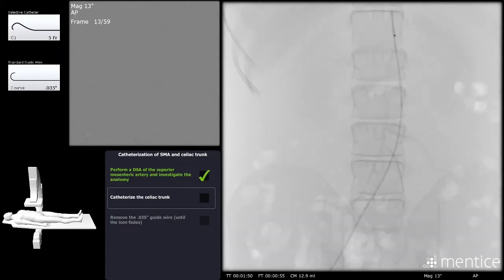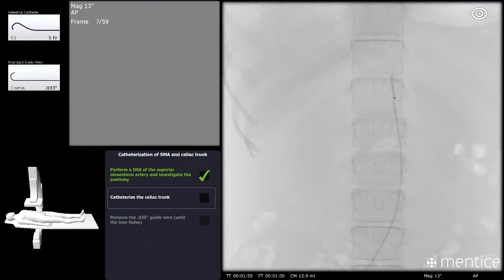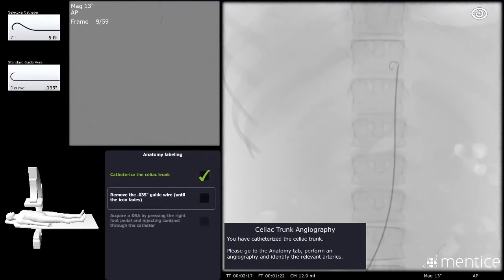This is to try and avoid any possibility of sending off clots or emboli when you go up to form the catheter higher up in the thoracic aorta or the aortic arch. Obviously, that's not necessarily required if you're using another form of catheter like a Cobra catheter where you're not forming the catheter loop. If I form the Sims, I would bring it back down. There are ways, most people would probably put a wire just outside the tip to prevent any catching off of any blood vessels and to be as atraumatic as you can. Some people may use contrast, but I personally would use the wire tip.